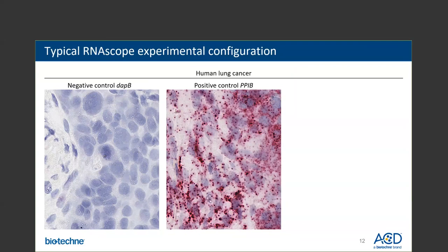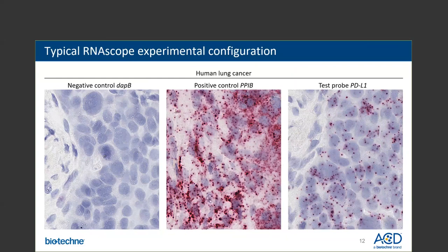With results from these two control probes, we can have confidence in the test data. In the rightmost panel, I am showing a section from the same lung cancer sample probed for the immune checkpoint marker Programmed Death-Ligand 1, or PD-L1. PD-L1 exhibits a wide range of expression in tumor tissues. In this human lung cancer sample, we observe strong punctate dots with the PD-L1 probe, indicating expression of PD-L1 in this tumor sample. The controls show good-quality RNA throughout the tissue and little to no background, so we can be confident that the localized pattern of PD-L1 expression is the correct result.